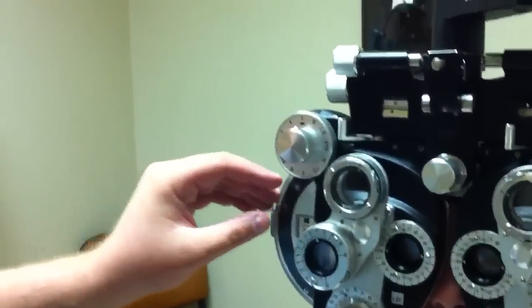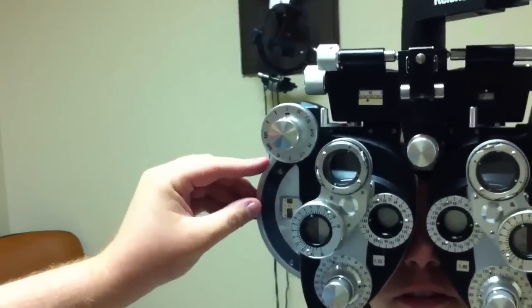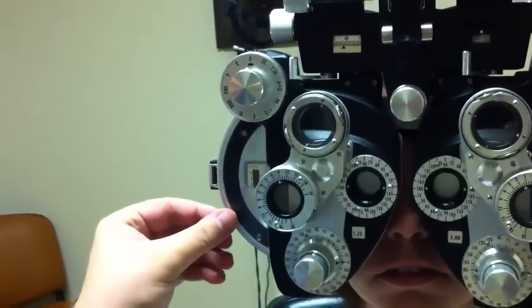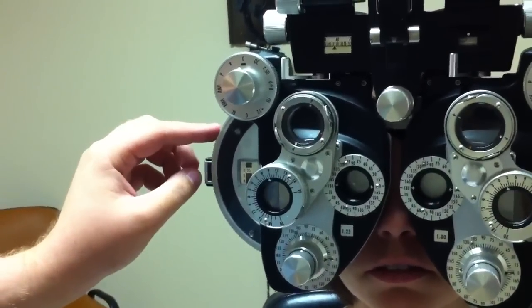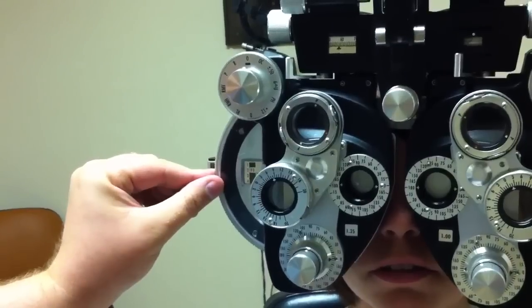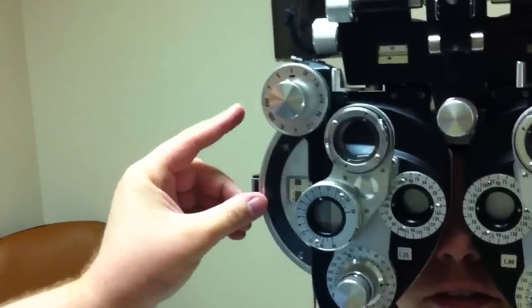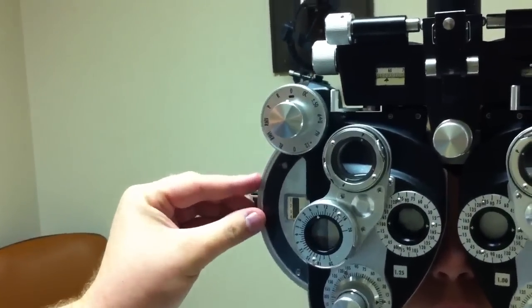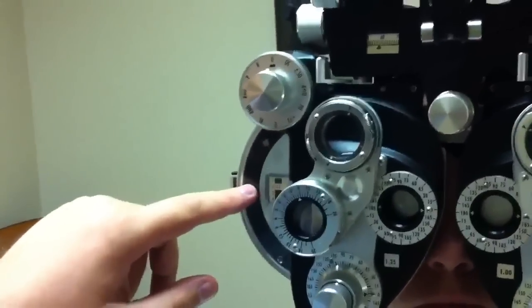First, I go one above and one below. I'm going to flip through some different lenses, Annika — let me know which one looks sharper. One or two? Two. Two or three? So I rechecked the middle one just to make sure. One or two? Two. She likes her original one, so now I've got the sphere down.